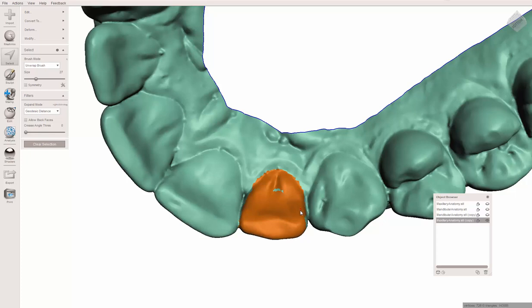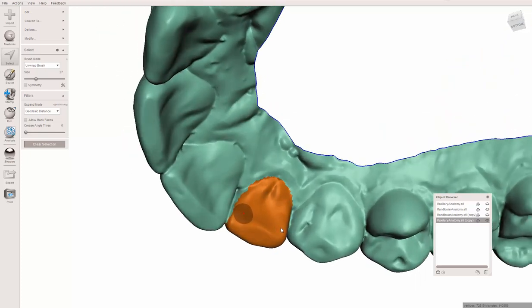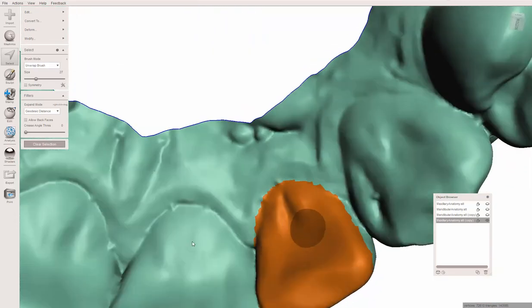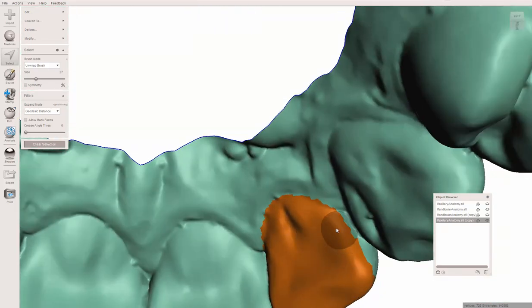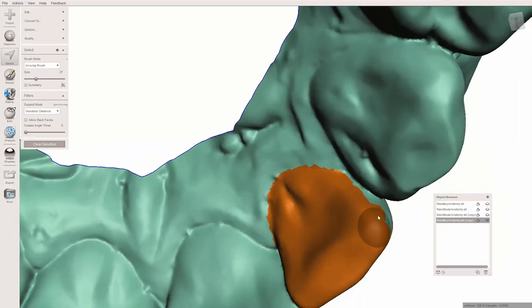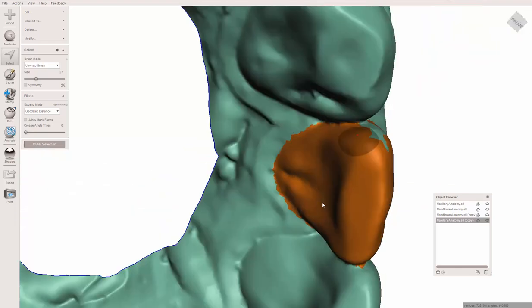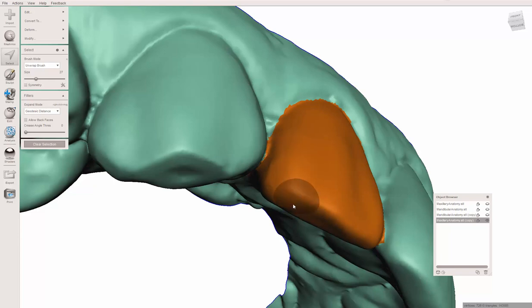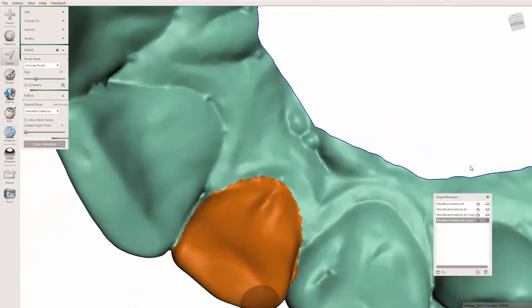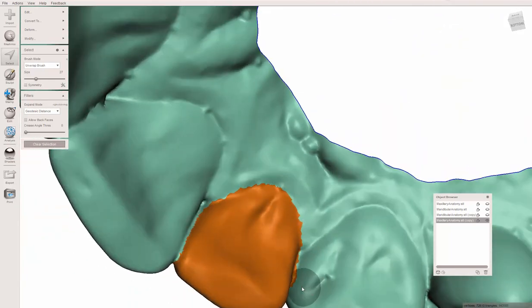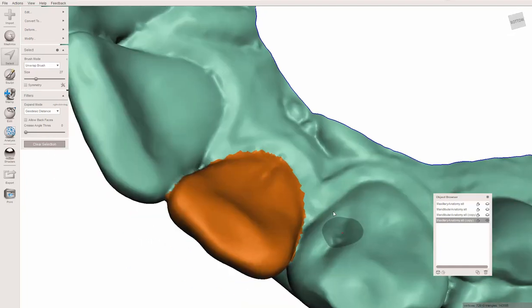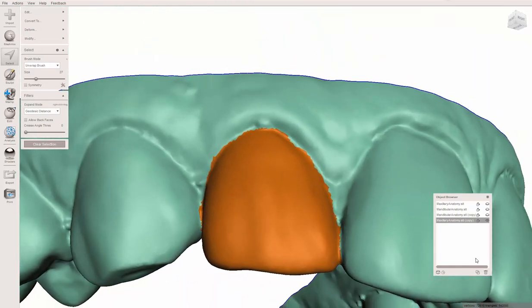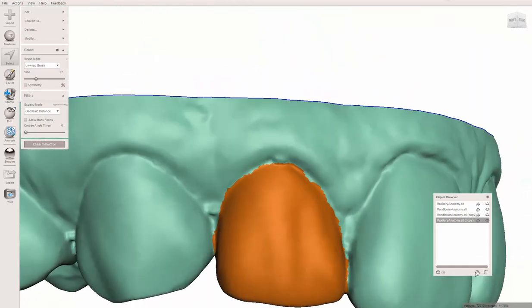My mouse kind of went haywire right there. If that happens, just hold the shift button and you can deselect anything that goes off. Again, this does not have to be exact. I'm going to spend a little time getting it pretty close and then move on.